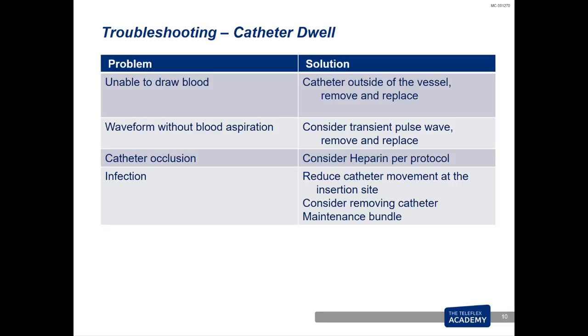Can you take your ultrasound and scan over the distal end of the arterial catheter to see where that catheter tip is sitting? And if you remove the catheter after this episode of no blood return, you pull the catheter out and hold pressure like you normally would for a routine arterial catheter removal, you may not have any blood return. And that would be a very positive sign that the arterial catheter wasn't actually in the artery anymore, and it was just sitting against the pulsation of the artery.